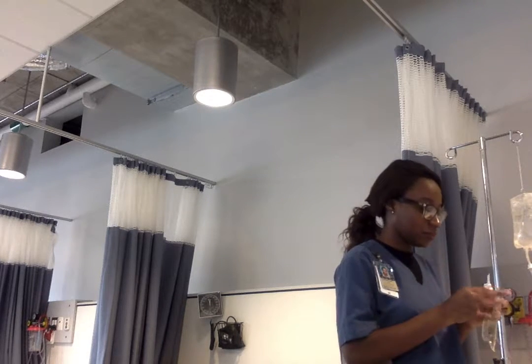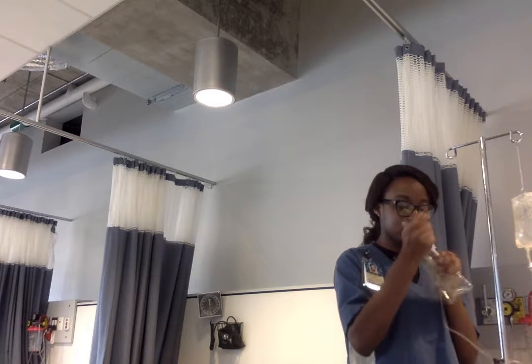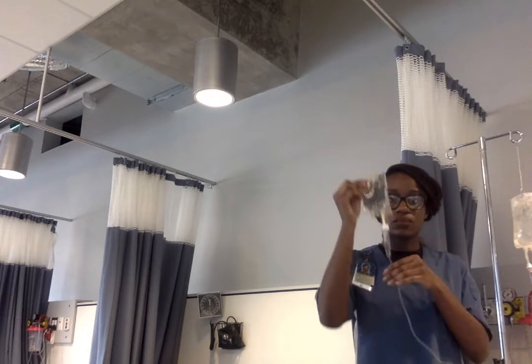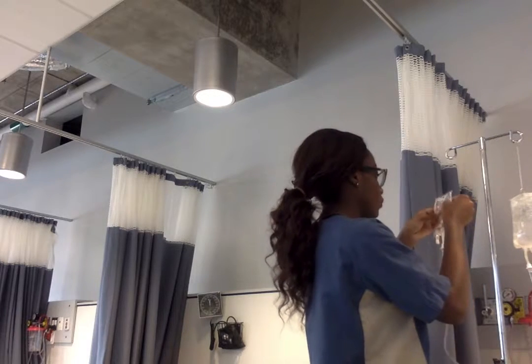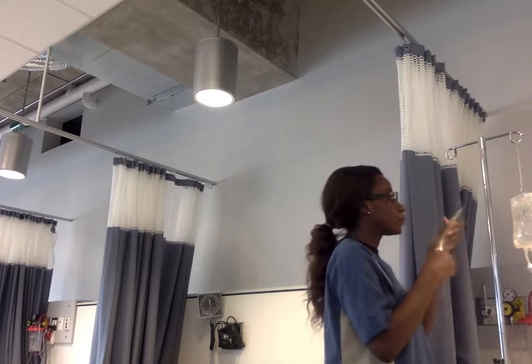So now I'm just going to spike my medication bag, my piggyback, making sure that this is locked, and avoid touching the tip because this is sterile. So I've spiked it.